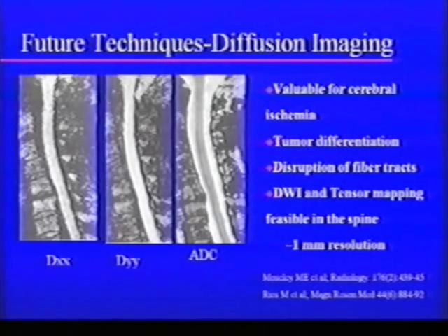And that's allowed us to diagnose stroke in the brain minutes after it occurs. Now, what would be wonderful is if you could step down to the spinal cord and use that same technology.